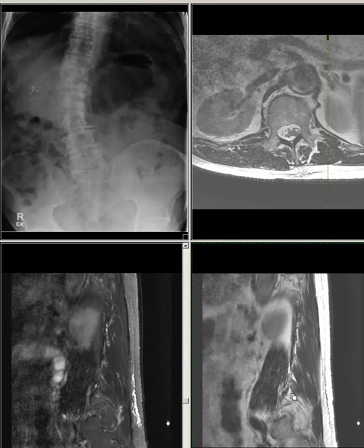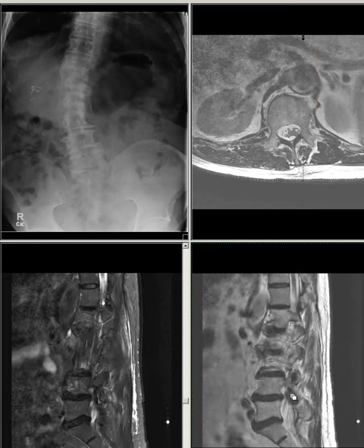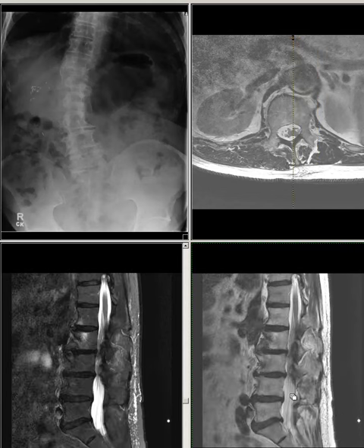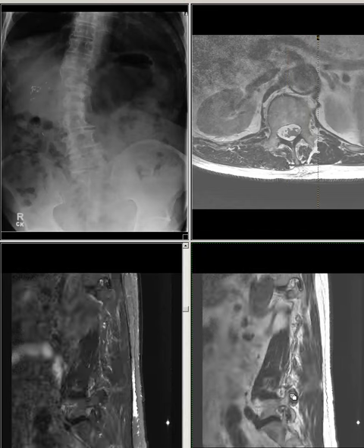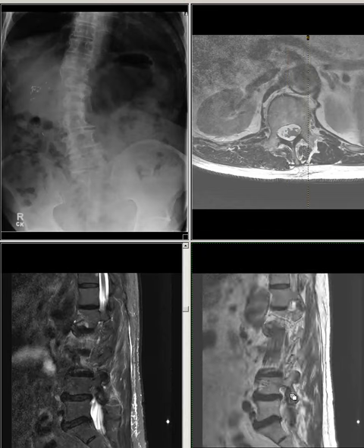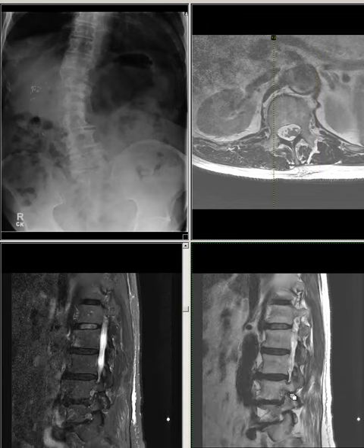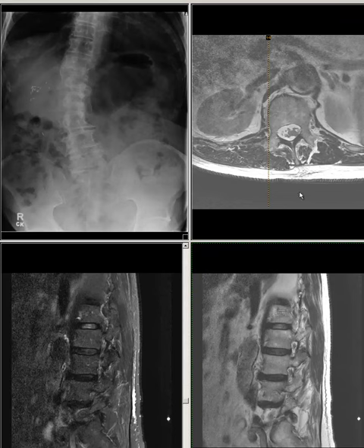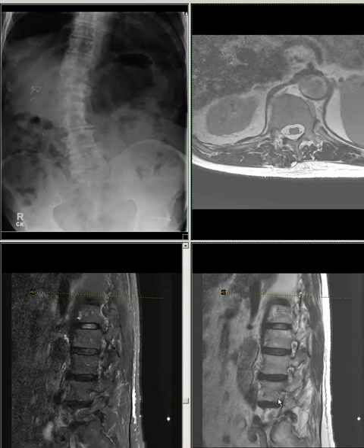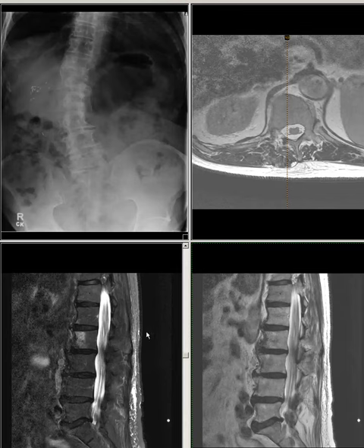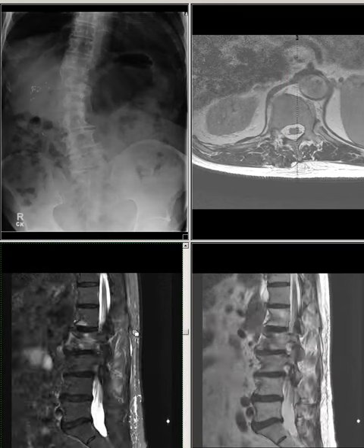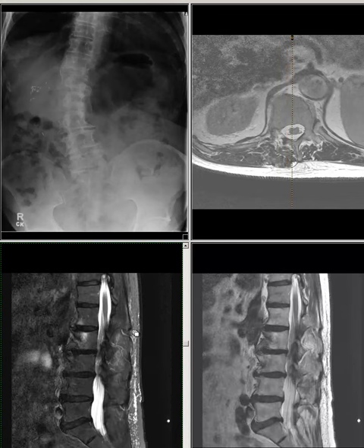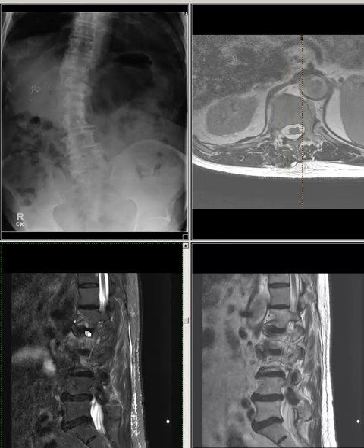Clinical correlation with possible radiculopathy is recommended. Fluoroscopic-guided nerve injection may offer diagnostic and therapeutic value. Subtle Modic type 1 endplate changes suggestive of subtle segmental instability at L1-L2 level on the left side.